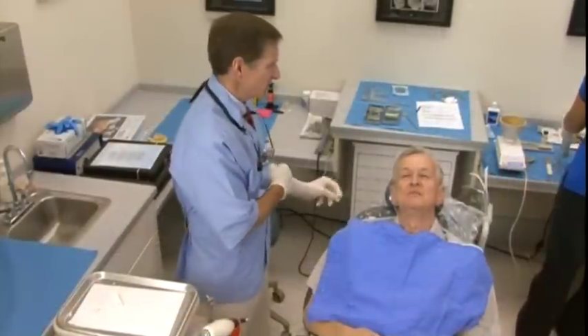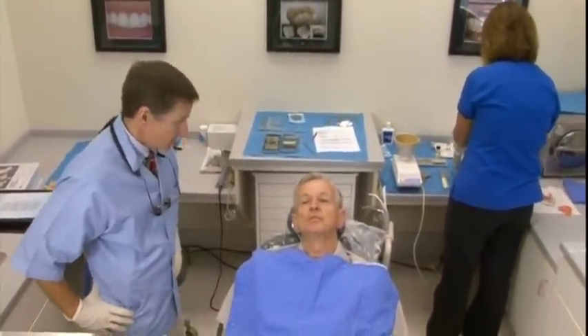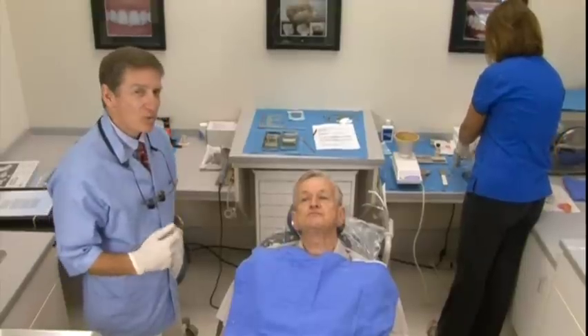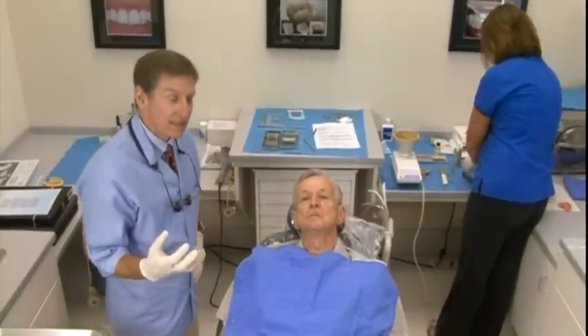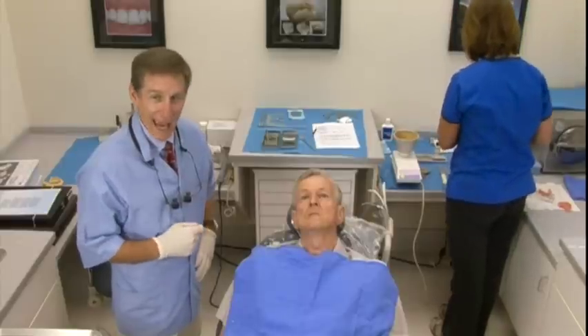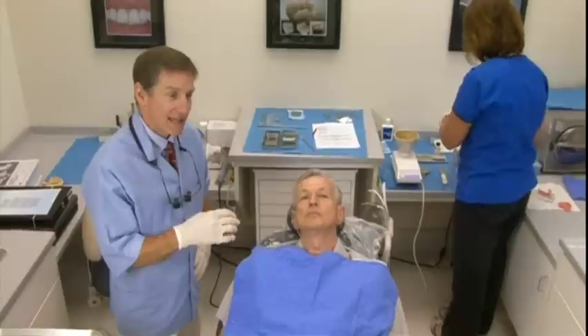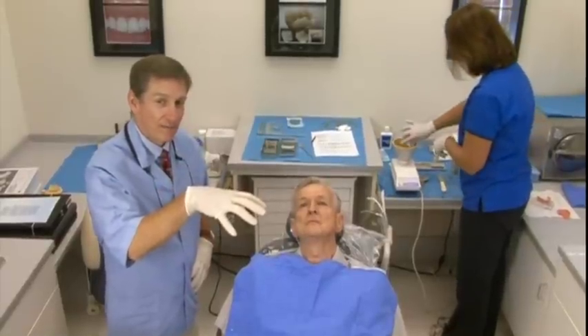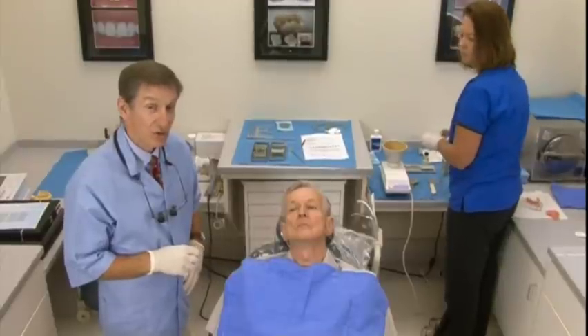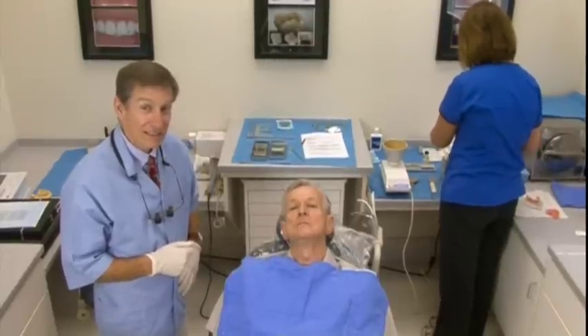Kathy's going to set us up to take the upper — same song, second verse. I can't give you a reason why I take the lower first, but in the back of my mind most patients are a little nervous about gagging. If you take the lower and let them bring their tongue up, they don't typically gag. You can demonstrate that you're going to do a good job, and the upper seems to be a little less anxiety-provoking at that point.